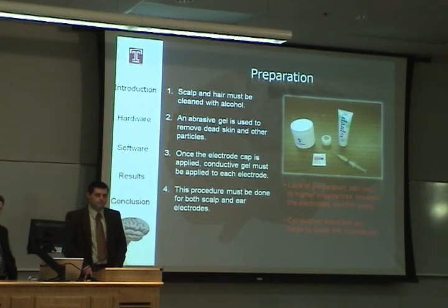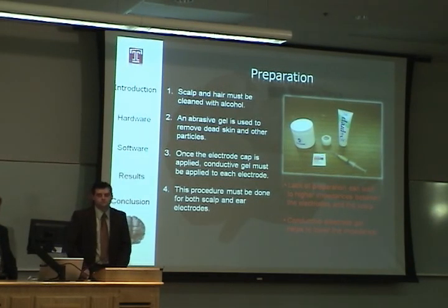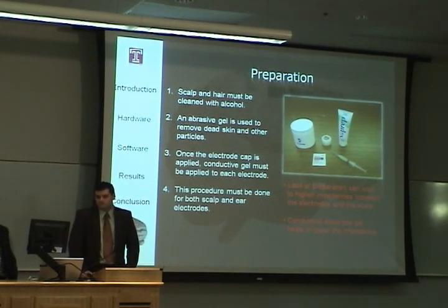What was the FFT size on the sample? 256, for 2 seconds of data. And the spectral resolution? I don't know. It should be some number inside our final report.